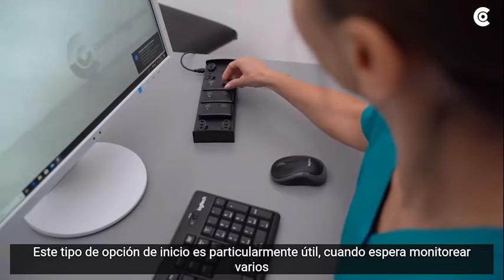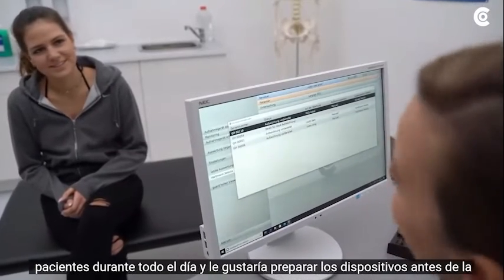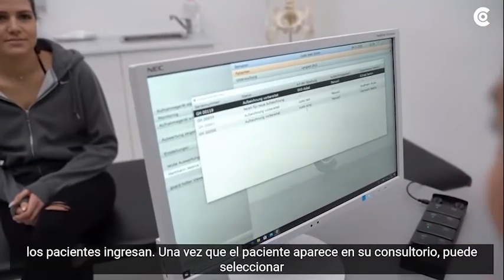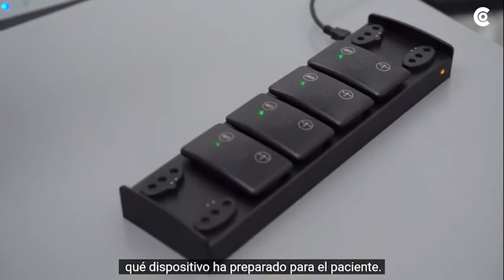This type of start option is particularly useful when you expect to monitor several patients throughout the day and would like to prepare the devices before the patients come in. Once the patient shows up in your office, you can select the patient from the Guard Holter viewer. It will also show you which device you have prepared for the patient.